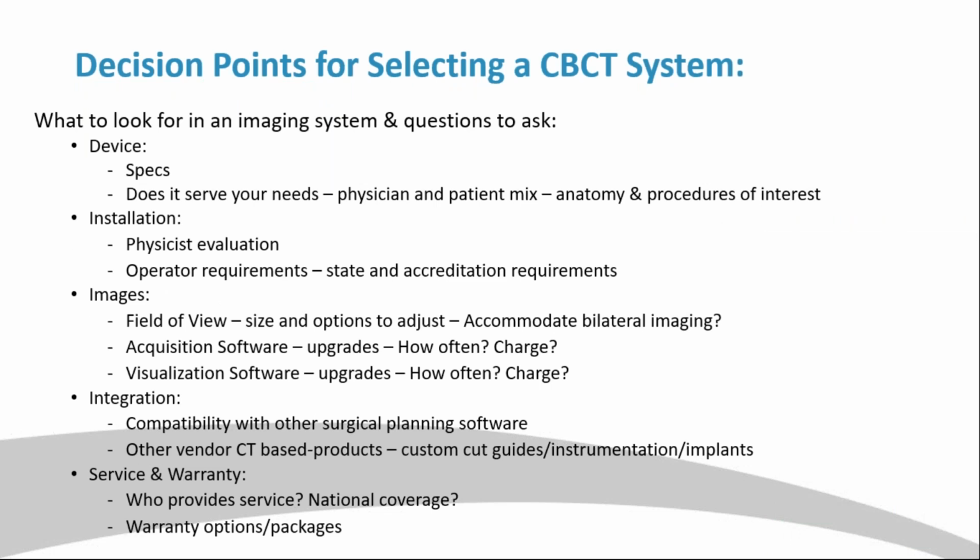But overall, it's hard to kind of keep this broad enough that it applies to all of the cone beam CT systems that are out there. But I tried to break this down so that for anyone who is out there and they are thinking about implementing this technology, I wanted to kind of give you an outline. If you're somebody who likes to get into Excel spreadsheets and really get your information organized, this might be a really good way to kind of outline what you're looking for so that you can make the decision that's best for you and your practice.